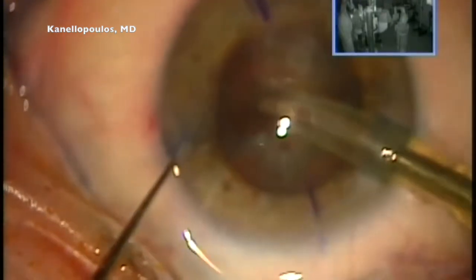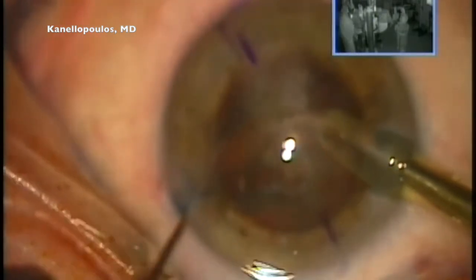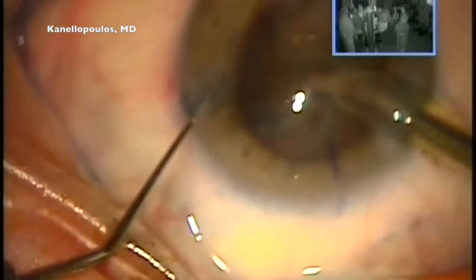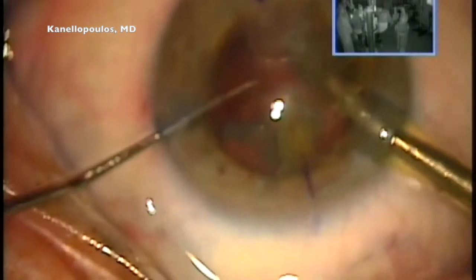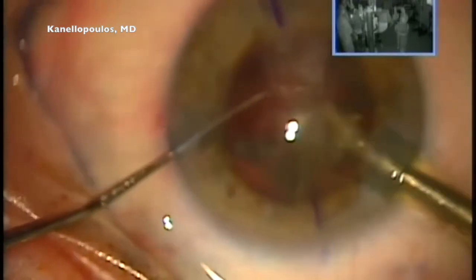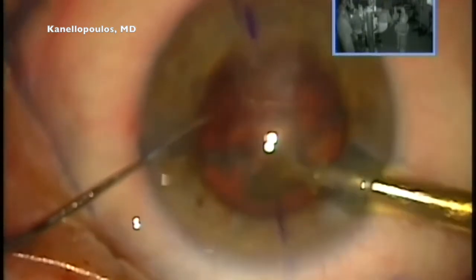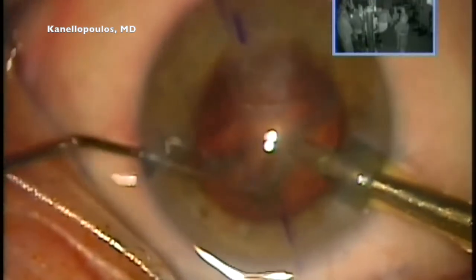We dissected the lens in 2 halves, and now I'm picking up with, this is the signature White Star probe, higher aspiration, only 10% phaco power. We're picking up the first hemi-meridian of the cataract to go on then and spin the other half of the cataract after we refill the anterior chamber with Viscoat.